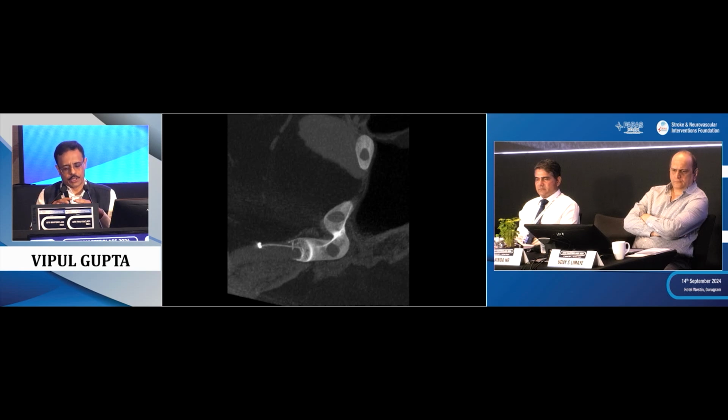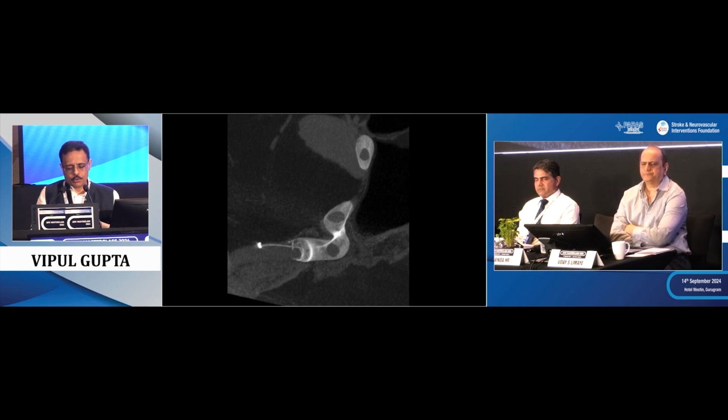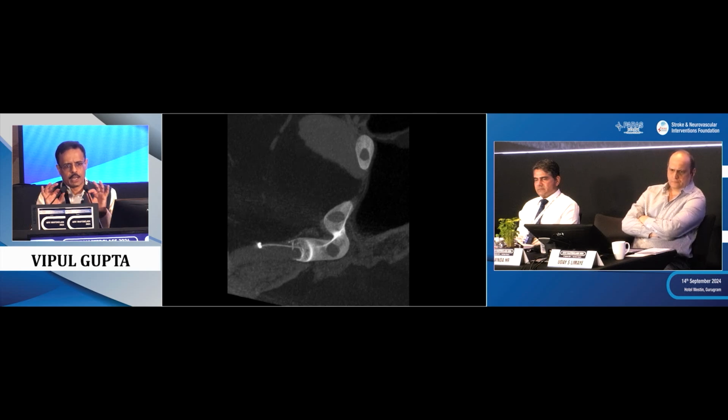So we used this CT scan image to enter the device, and I used a hybrid wire over a 17 microcatheter. All right, like Uday you mentioned, a very soft wire, didn't try with a 27 micro at all. So we used a very low-profile microcatheter, I think it was Duo, with a hybrid wire, crossed it softly so we don't damage the stent anymore.